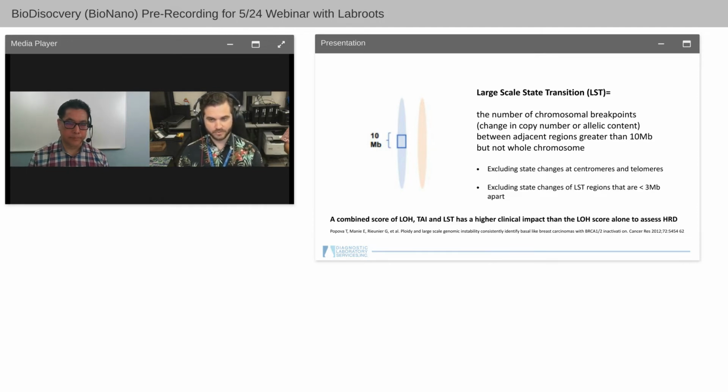So we have to be respectful to it. There's ambiguity as to why certain things during mitosis and meiosis may actually co-occur, and so we rule those out in our scoring calculation.